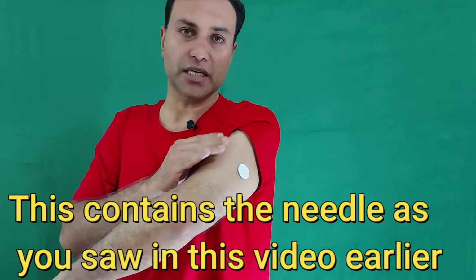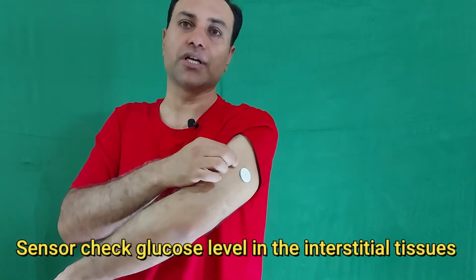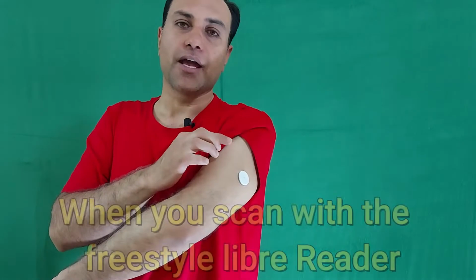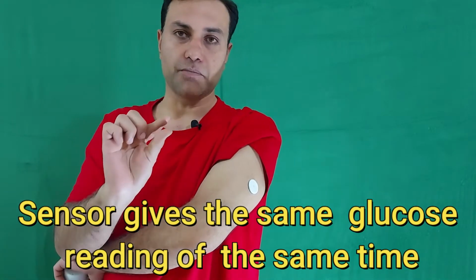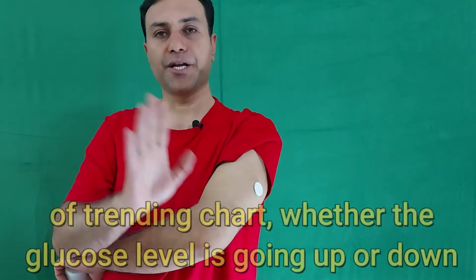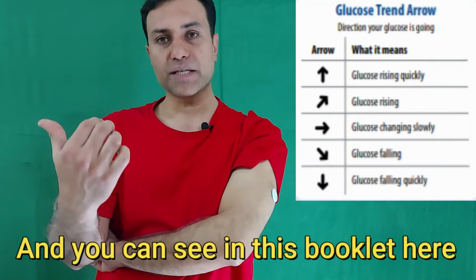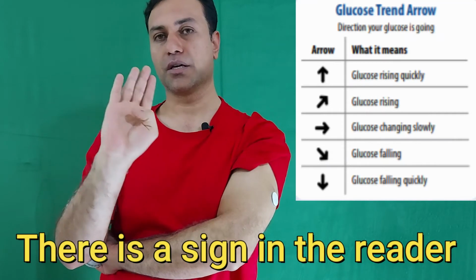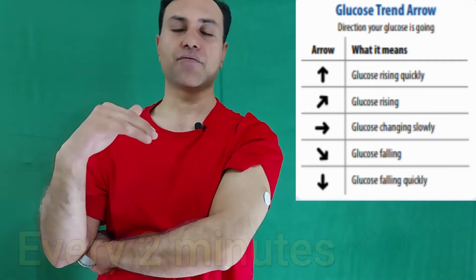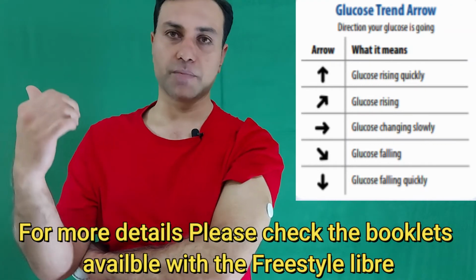Now how it works: this contains the needle, as you saw in the video before. This goes inside the tissue and checks the glucose level in the interstitial tissue. The sensor saves the data at 15 minute intervals, and when you scan with the reader, it gives you the same glucose reading at the same time, plus gives you the information about the previous 8 hours trending chart, whether your glucose level is going up or down. And you can see in this booklet here, there's a sign with the reader which I will show you now. This gives you the indication whether your blood glucose level is rising or going down every minute or every 2 minutes. For more detail, please check the booklet available with the Freestyle Libre.